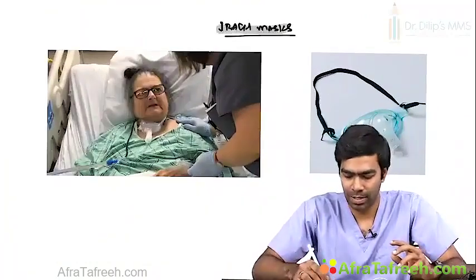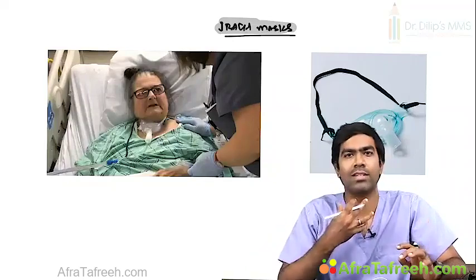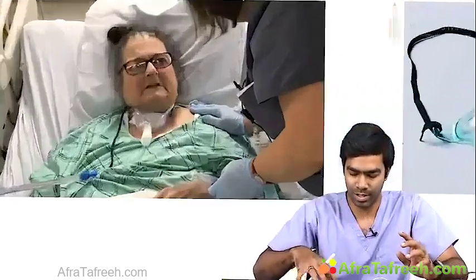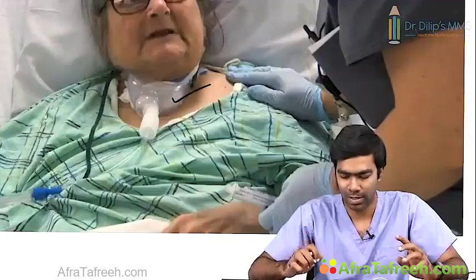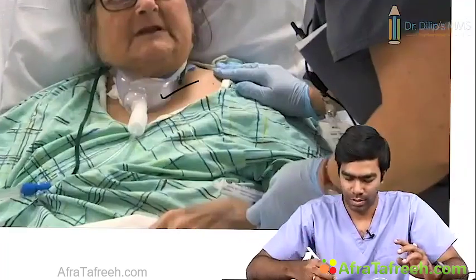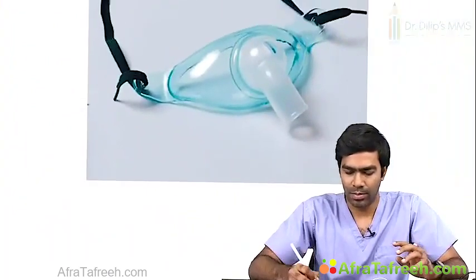Then these are the tracheal masks. I generally call it a trach mask. So it's like a face mask for the tracheostomy patient. You can see this image is very important. This is a tracheostomy patient with the tracheal mask attached to them. This is the oxygen that is coming. Clear? This is how a tracheal mask looks like.